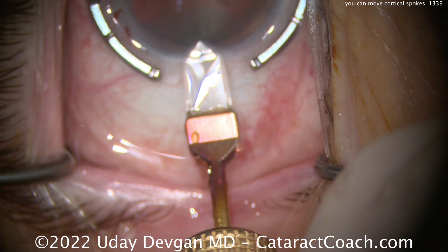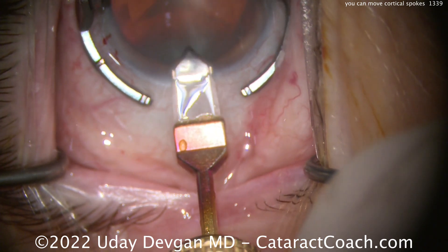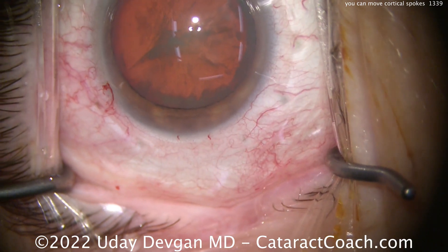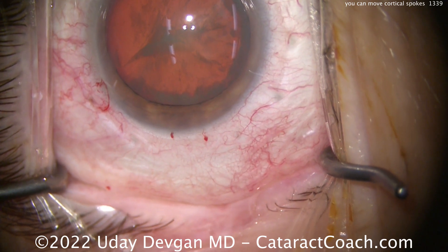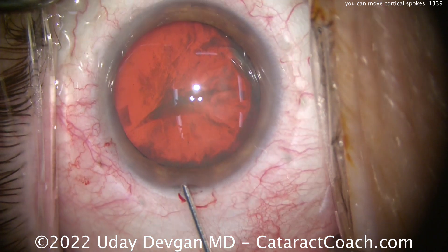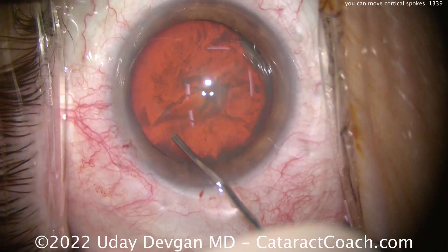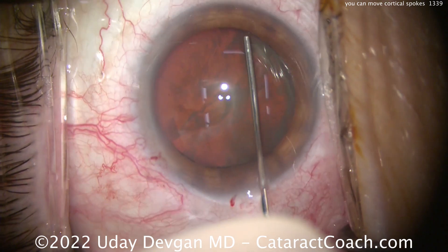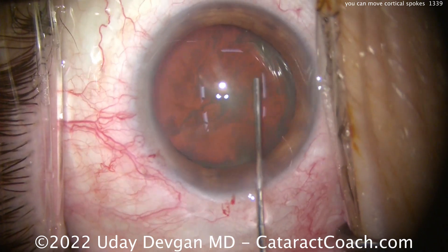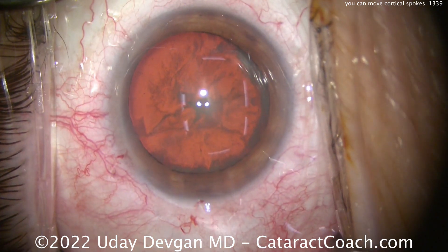We'll make our incision here using a diamond keratome. And then I'm just going to use a blunt cannula to push that cortical opacity out of the path of the capsulorexis — push it centrally. Just using a 27-gauge blunt cannula to sweep and push that cortical liquefied material centrally and get it out of the way, so when the capsulorexis is being done, the pathway in the red reflex is perfectly clear.